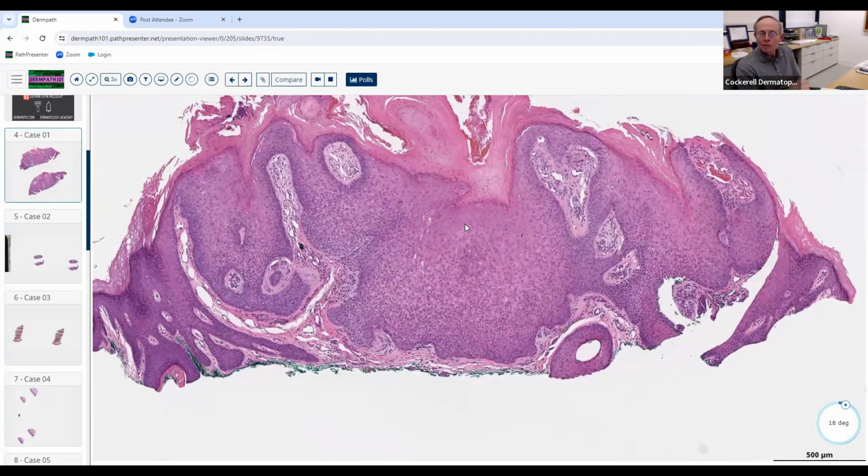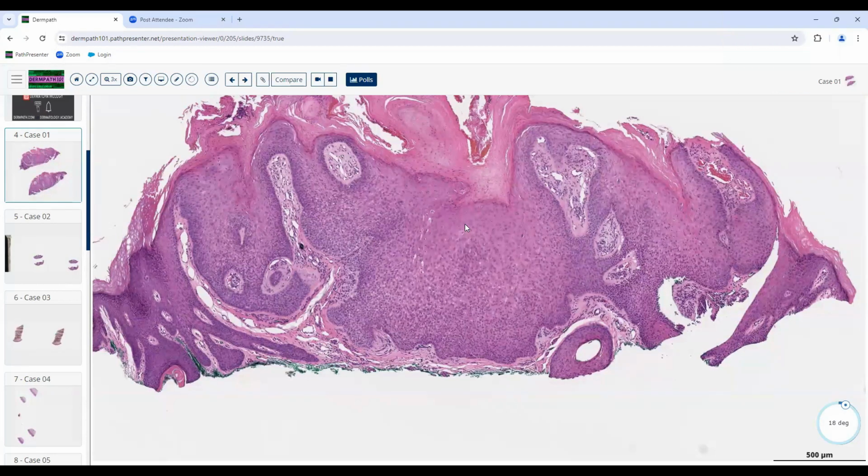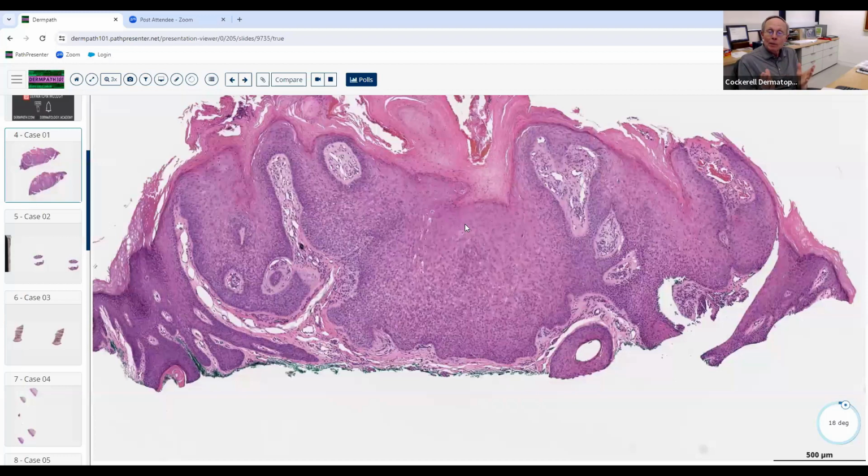It's where the bulge lives, and that's where the cells originate that repopulate the lower part of the follicle when the follicle goes through cycling. So the answer is sort of yes, because that's where the stem cells live. But in a normal hair follicle, the outer root sheath is in the lower part. You have the infundibulum, the isthmus, and then the inferior portion. So it's in that inferior portion, and it is on the outer side.